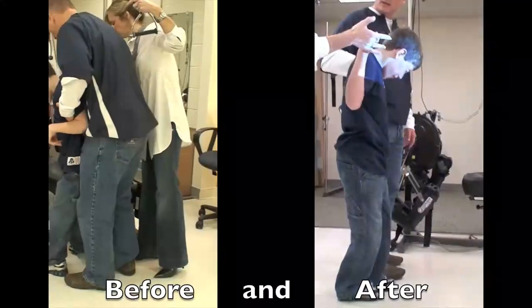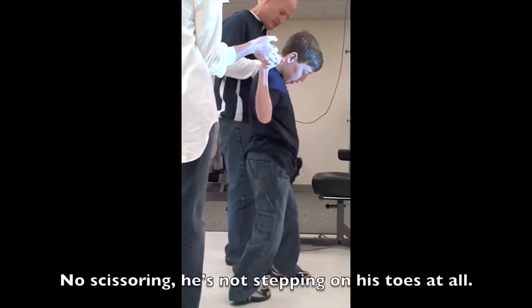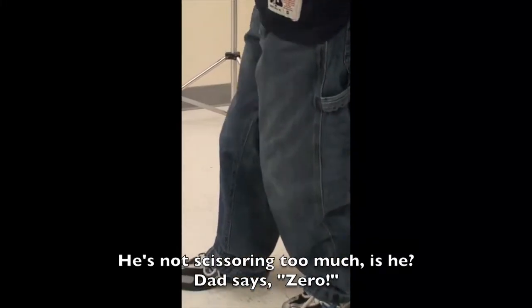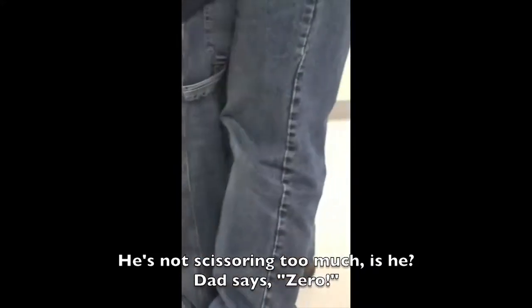Yeah, you just never know. He's pulling me a lot, but I've seen him doing no scissoring before. He was stepping on his toes. But he's not scissoring too much — zero. Yeah, normally when I say scissor, normally he's like crossing. It's hard because this one's dragging to cross.